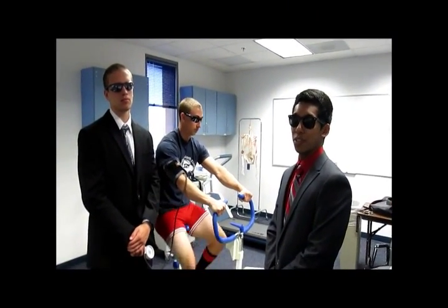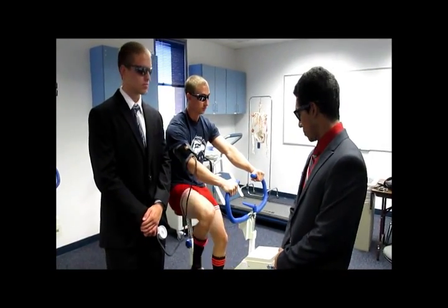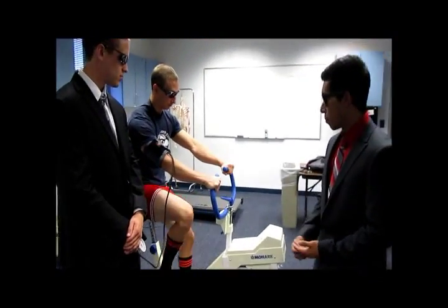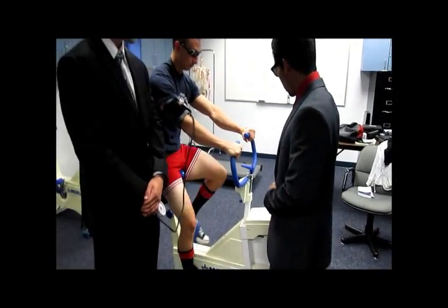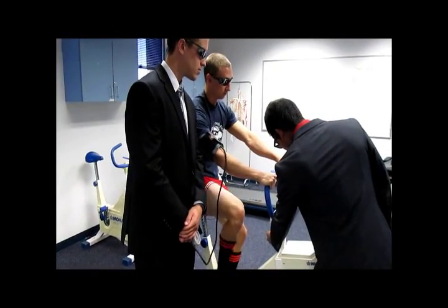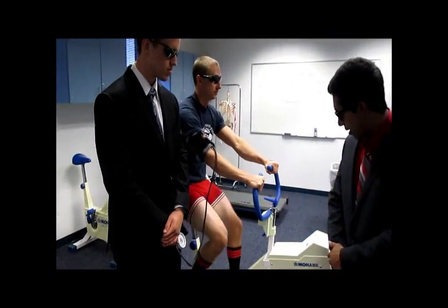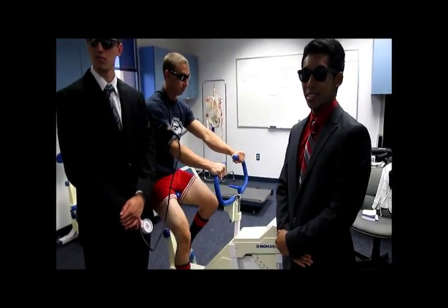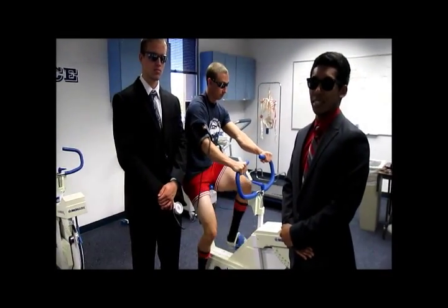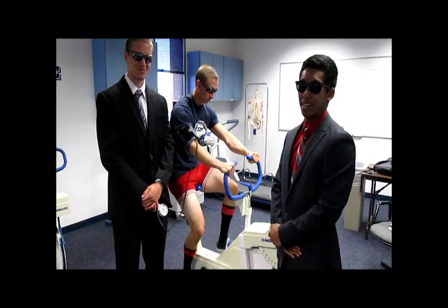First we'll have the participant warm up for 2-3 minutes. After warming up, we're going to start with the initial stage — we're going to set the bike to 150 kgm per minute and have the participant pedal for 3 minutes. In between the 2-3 minutes of each stage we're going to take blood pressure, and 15 to 30 seconds at the end of each stage we're going to take heart rate.